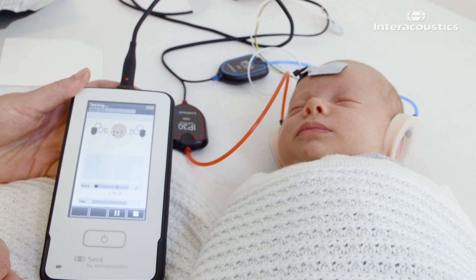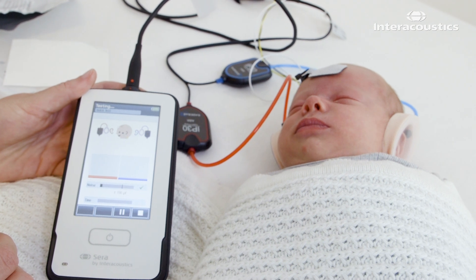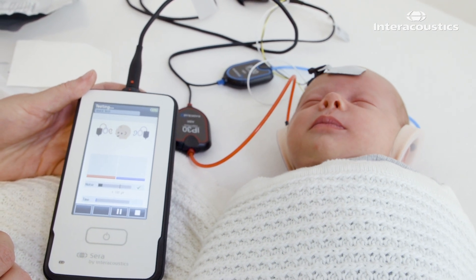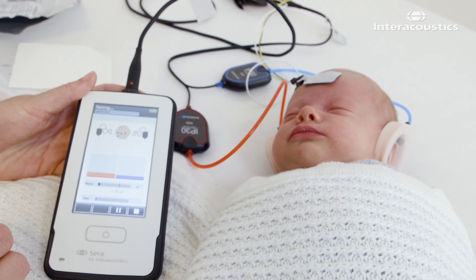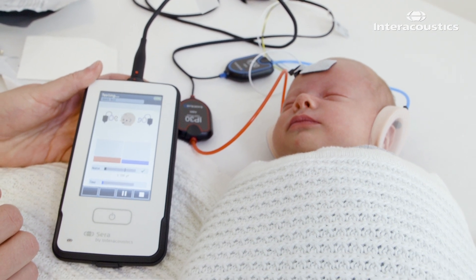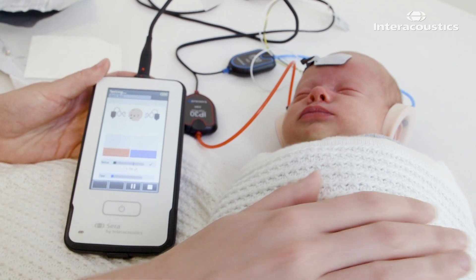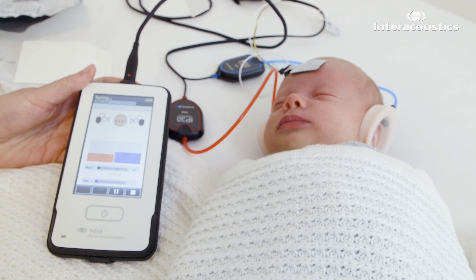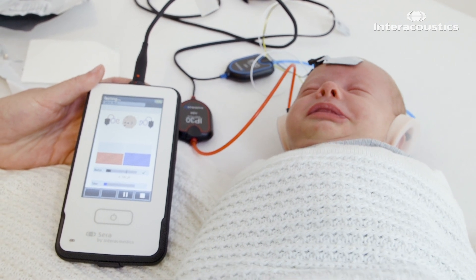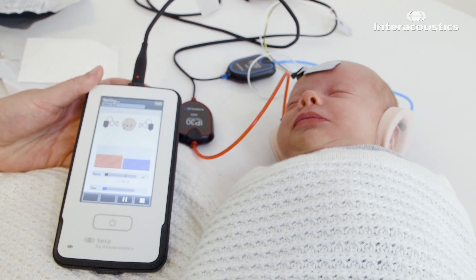We have a maximum test time of 3 minutes, but usually we will already have a result within 20 to 30 seconds. You can see the test is progressing nicely for this patient. The more unsettled and unquiet your patient is, the longer it will usually take.